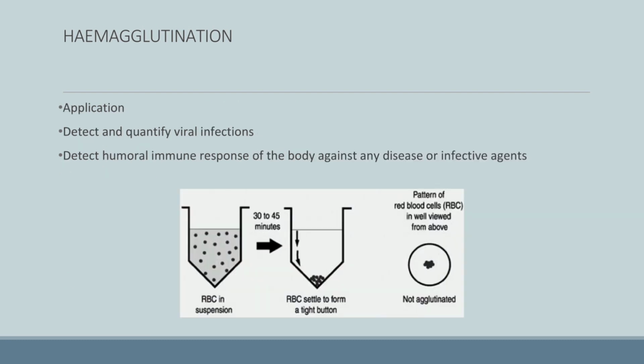Applications involve detecting and quantifying viral infections such as paramyxovirus and influenza. Then to detect the humoral immune response of the body against any disease or infective agents.